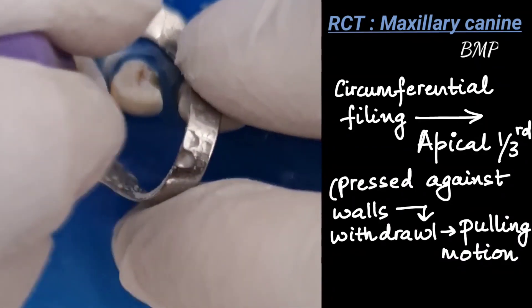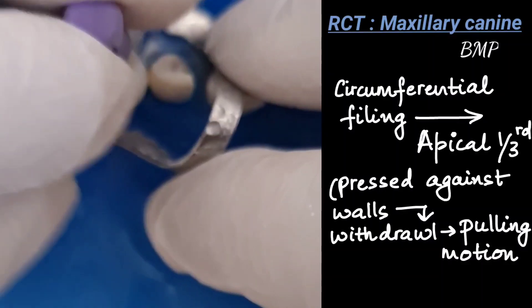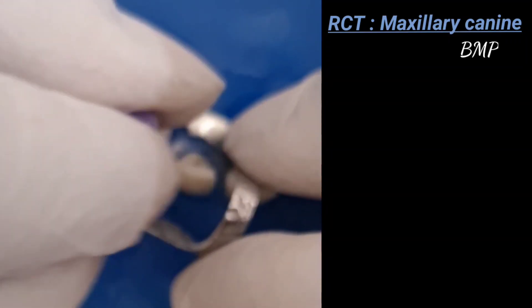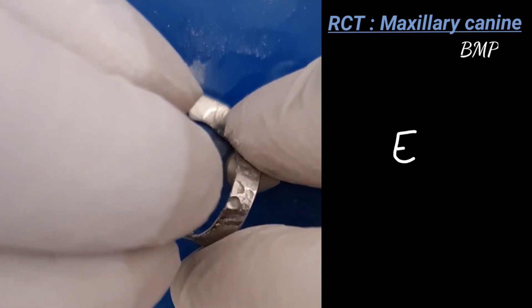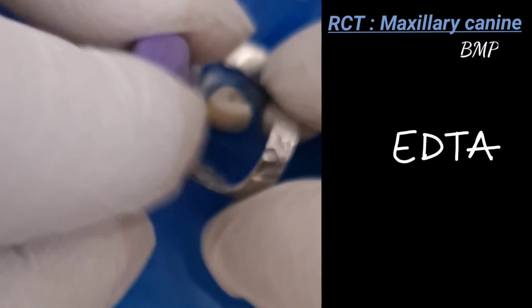Circumferential filing: the file is inserted into the root canal up to the apex, then laterally pressed against one side of the canal wall and withdrawn with a pulling motion. It is done to file the dentinal walls. For the apical one-third, we do circumferential filing and use EDTA along with the instrument every time.